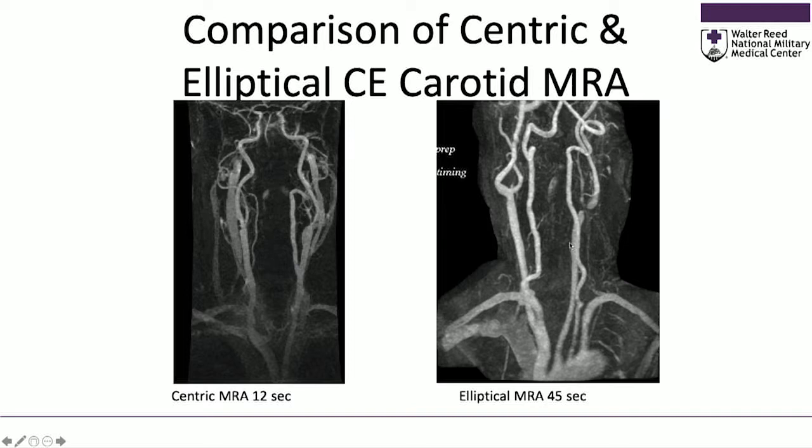As Giles mentioned this morning, we were all aware of our limitations with centric imaging, that it took about 1/3 of the acquisition to cover the central part of K-space, and given that we have about 4 to 5 seconds separation between peak arterial and peak venous enhancement in the neck, that meant my study couldn't be more than 12 seconds.